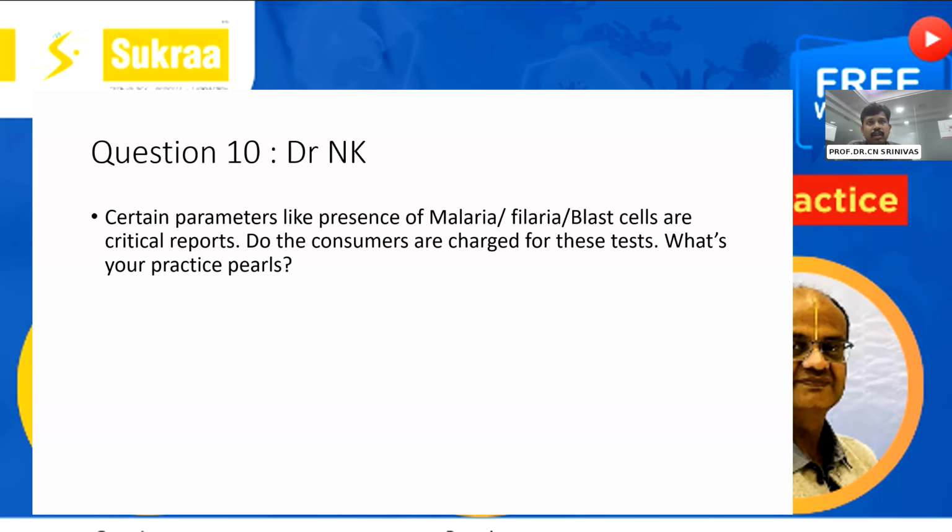So informing critical reports is mandatory. There is no second thinking about it. And even if they are not charged for it, it is our duty to inform immediately, as soon as possible, as quickly as you can verify them on smear also. But when you are informing, I would say it is better to have a history with the patient, so you'll know what made the patient give the sample in the first place, and the conditions in which, even if you're not anticipating, you can get these alerts.